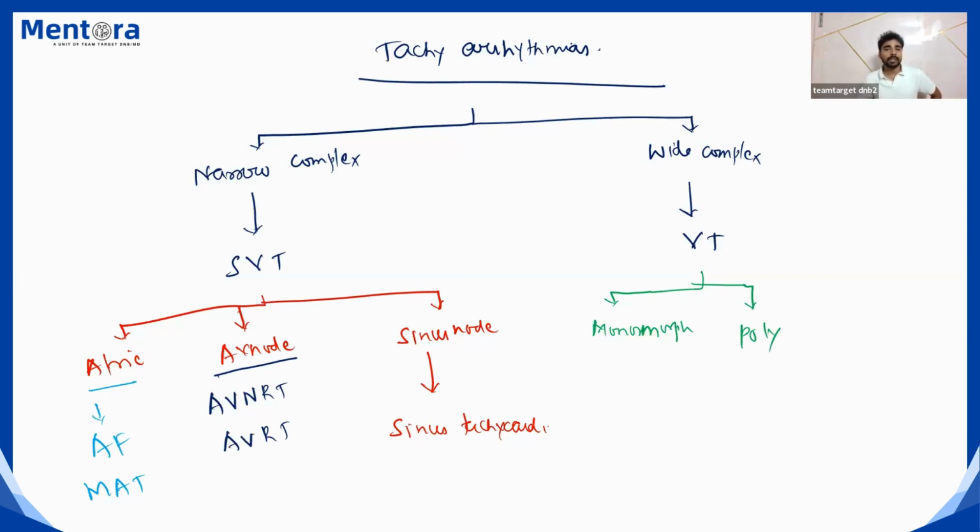So now we have to delineate everything. We have to identify all these things. So this classification is clear. If you have this understanding, it's very easy to identify the ECGs. So this is the basic understanding I want to give you before starting the ECGs, right?